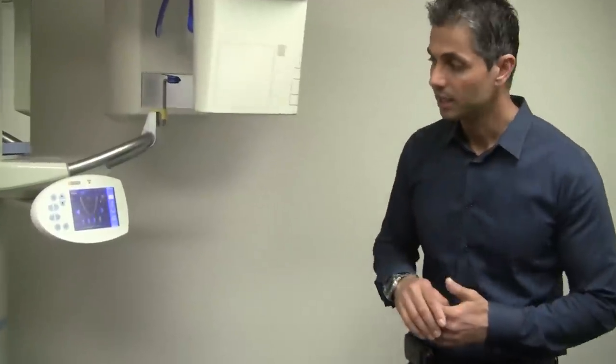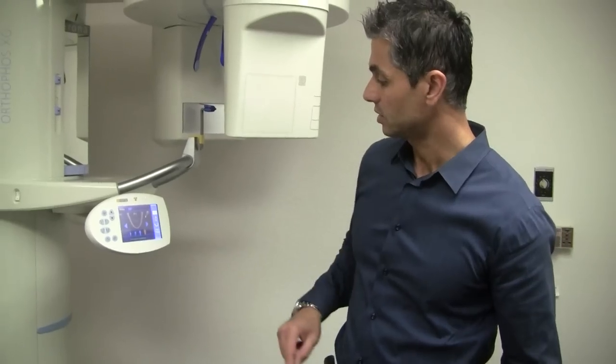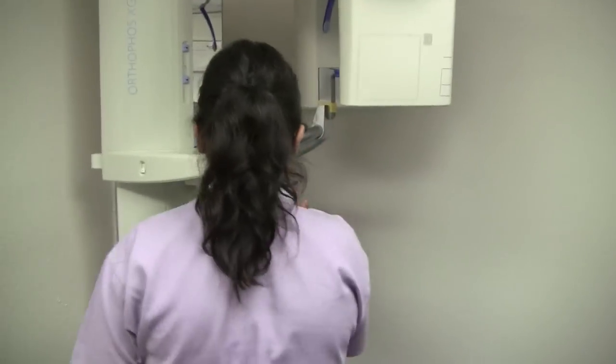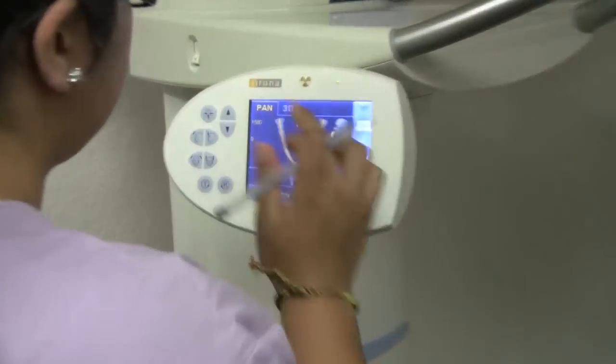If we were going to take 3D — and I think we could — is it set up for you, like you have here? So just go ahead and select the tab that says 3D. There we go.